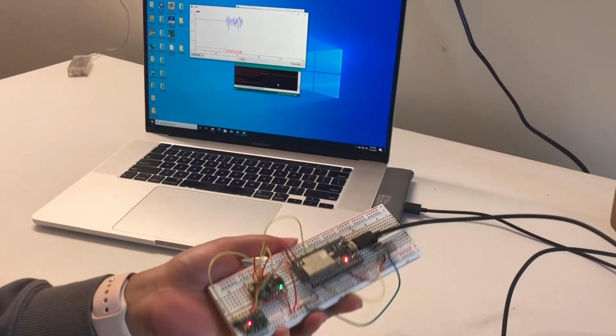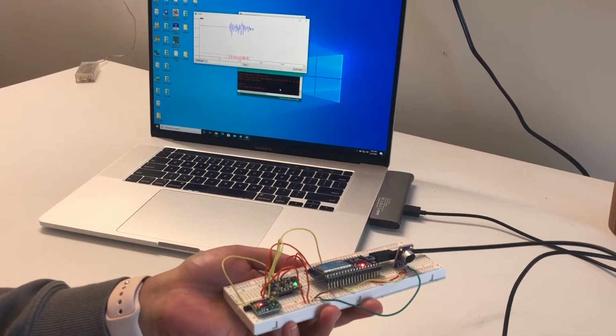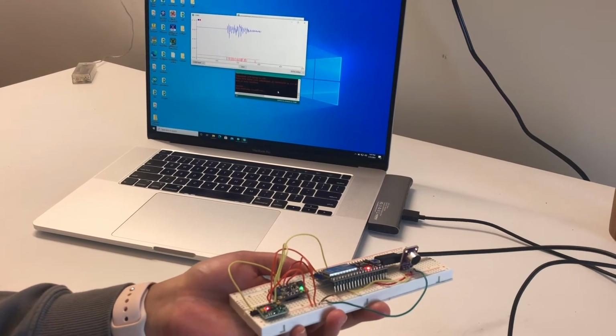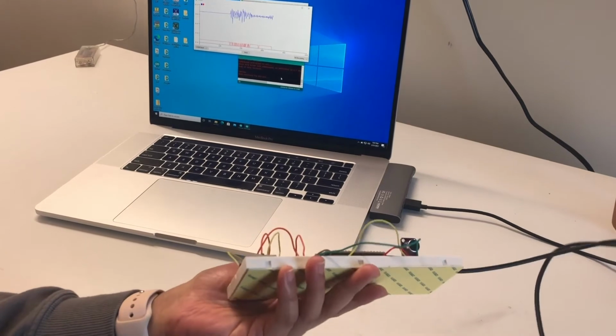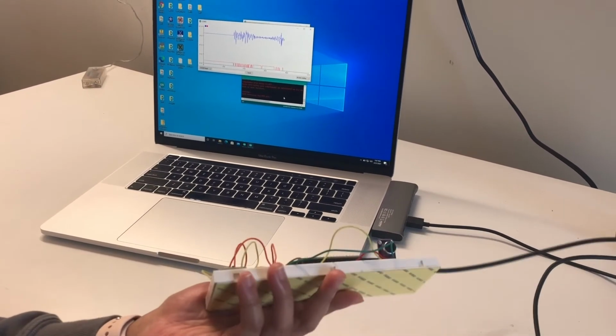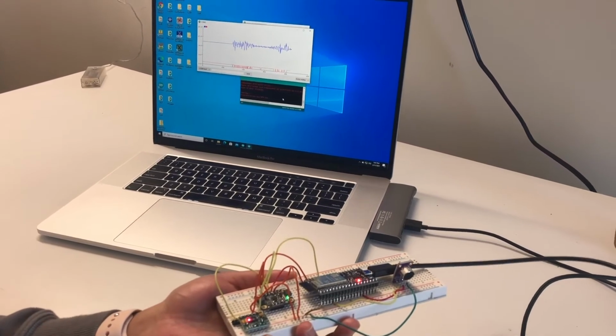Basically, it's using the X, Y, and Z values read from the accelerometer and calculating the motion out of that. And then for the supine value, basically it's an algorithm from a research paper that I found, which compares the X, Y, and Z values and determines whether or not somebody is on their back. And so that is our accelerometer and gyroscope.